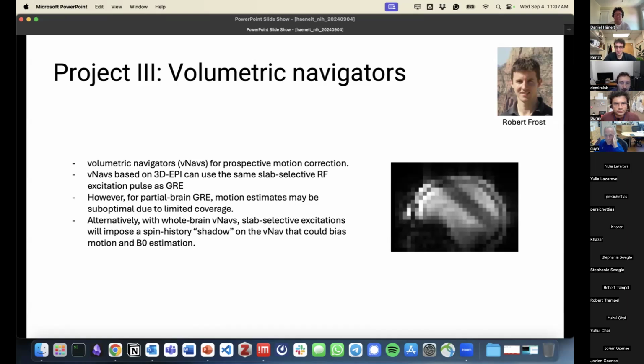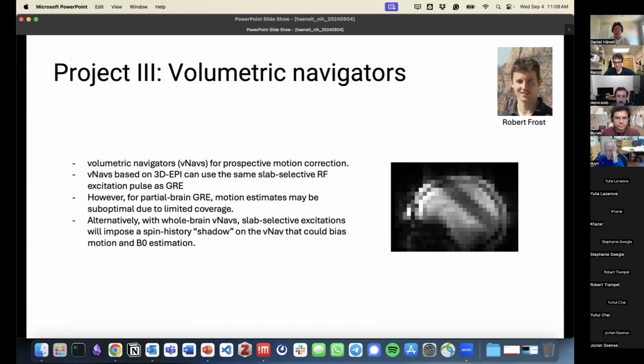And one additional question: volumetric navigators are only required when you have no option of multi-echo recording, like VASO. Is that correct, or is it better? I'm trying to understand, if you have the chance of having multi-echo, can you do motion correction that way?